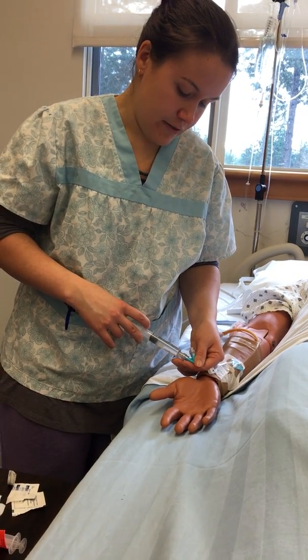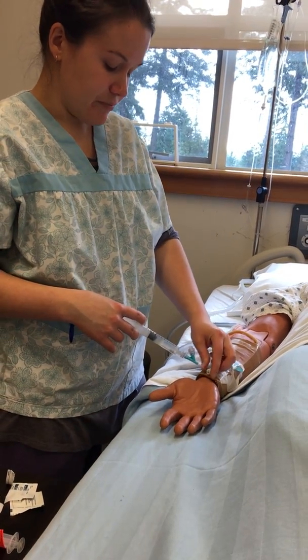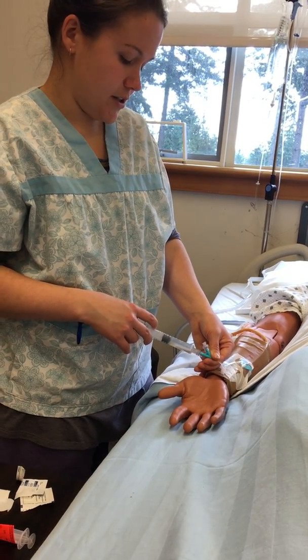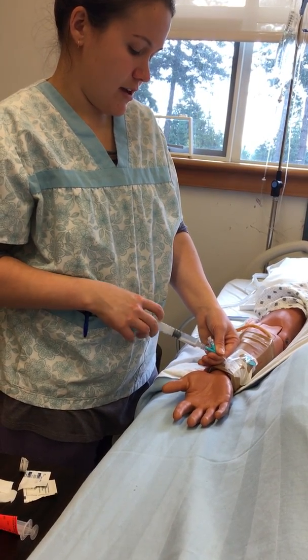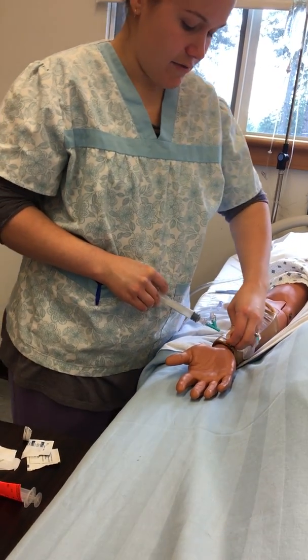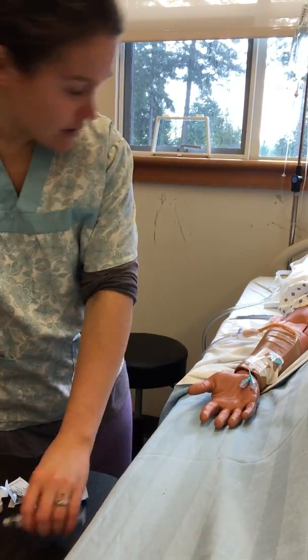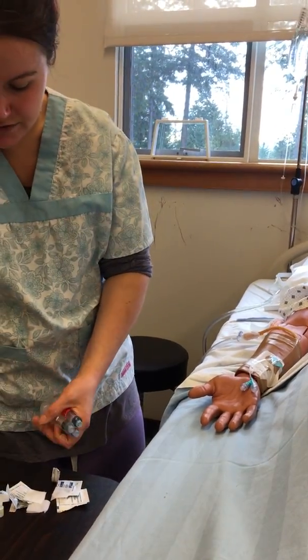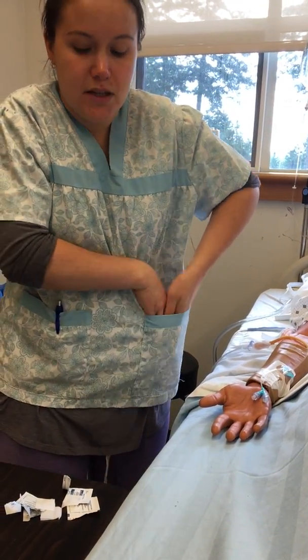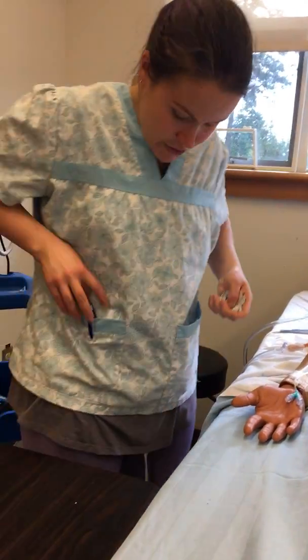Okay, so 1 full minute goes by. Okay, now that 1 full minute has gone by, I'm going to push a little faster. So we'll do the push, push, pause thing again. Half a mil, half a mil, half a mil, and then you push the whole entire rest of the vial, not vial. What is this thing called again? Syringe. Woo. Then I'm going to take this stuff, throw everything in the garbage. I won't though, because I'm going to keep this. Okay, so we'll pretend I threw all that in the garbage.